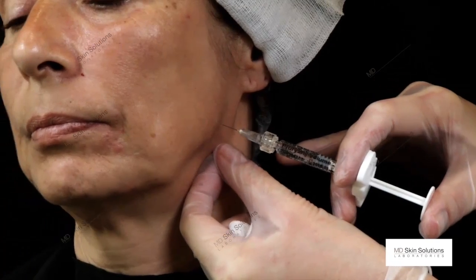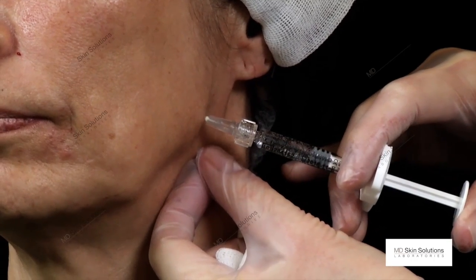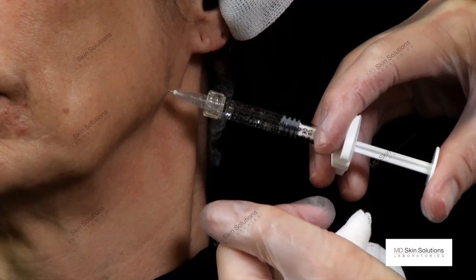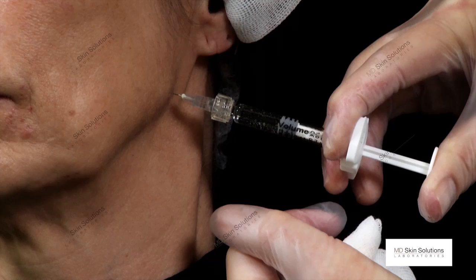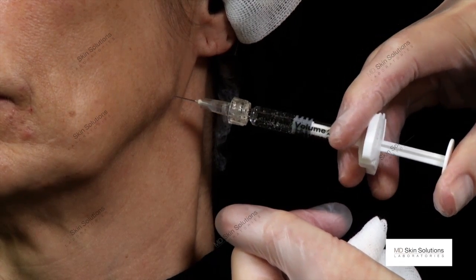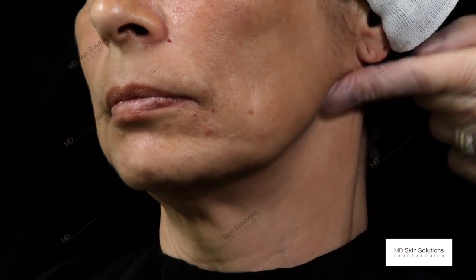And now we will address the mandible angle. Straight to the mandible, to the angle, I touch the bone and place a 0.2 of Pluryal Volume in order to redefine this angle.